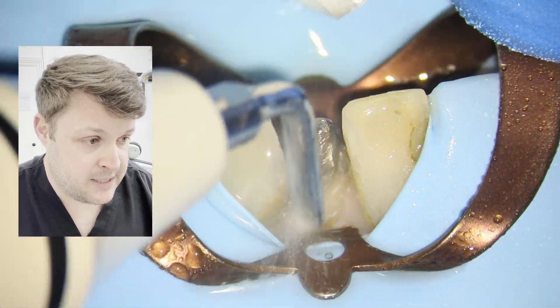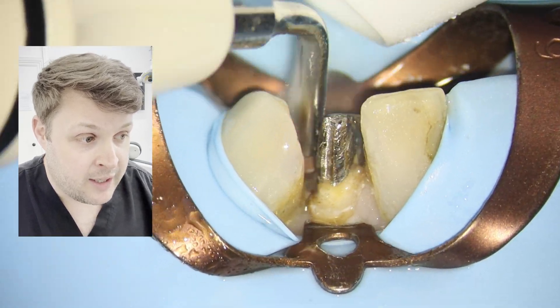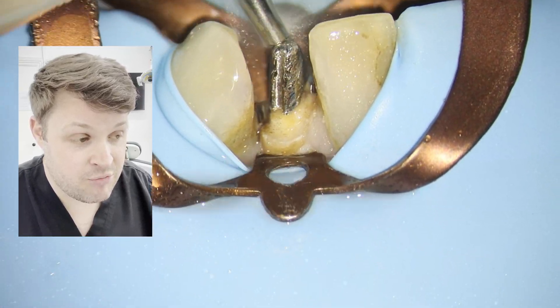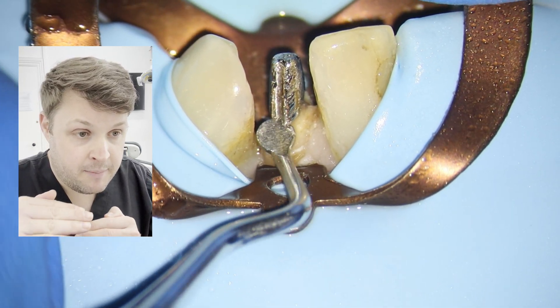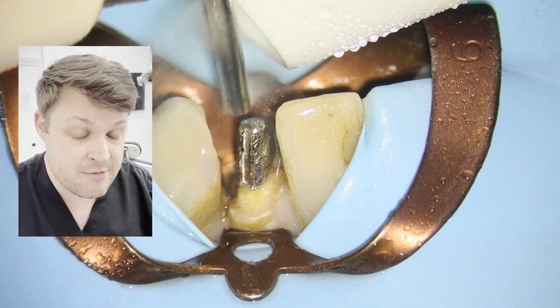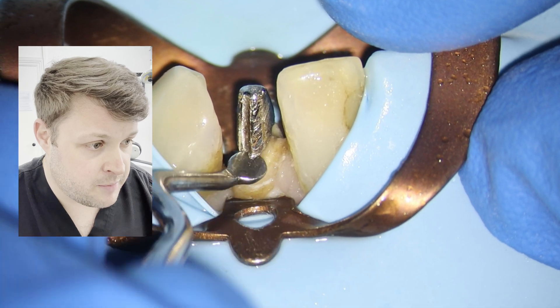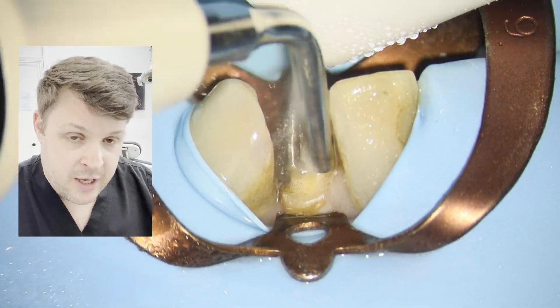Weirdly enough, with this particular post it was moving quite significantly before it actually started to elevate out. It's really really loose at the moment, and you would have expected with a straight-sided smaller post that this would come straight out. But I think because of the serrations it's locking into the inside of the tooth. There's a lot of movement there, and all you've got to do is keep vibrating and keep trying to undermine the post.